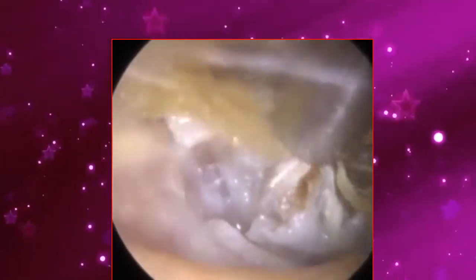So I'm just trying to remove it here off the anterior, the front part of the ear canal. You can see the skin layer there, so I'm giving it a good wriggle and a tug. I'm at the base of the ear canal. You can see that fresher layer of dead skin forming, the whiter layer on the right where I am now, slightly older. It's more pale yellow. I'm really working this off the back part of the ear canal. It's really strongly adhered.